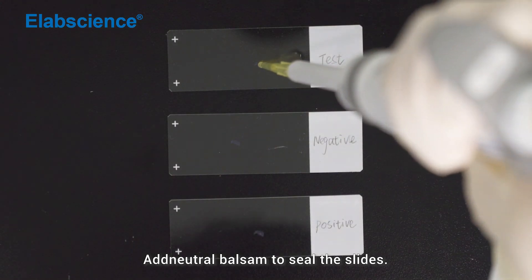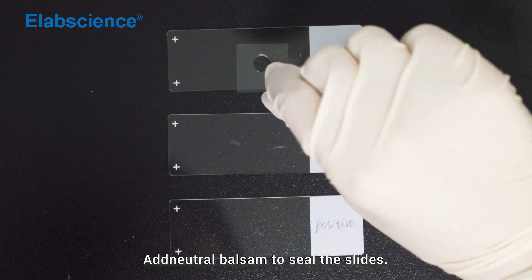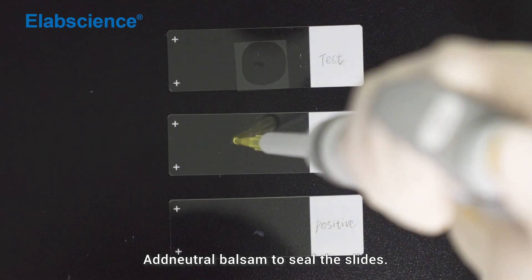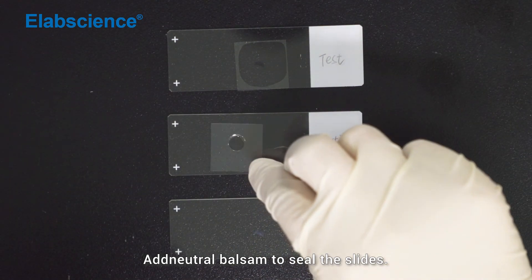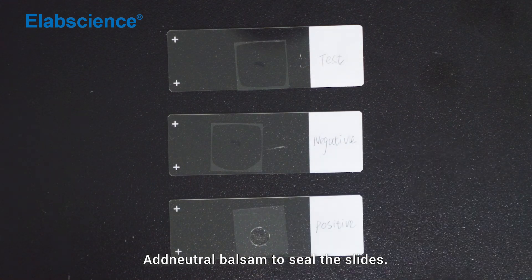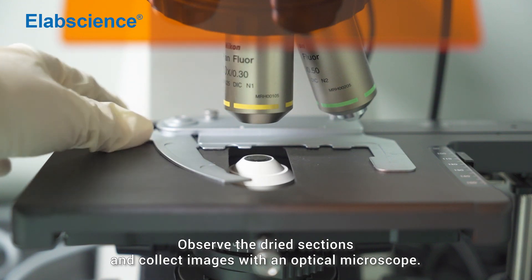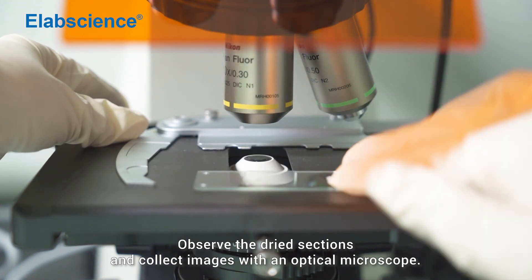Add neutral balsam to seal the slide. Detection: observe the dried sections and collect images with an optical microscope.